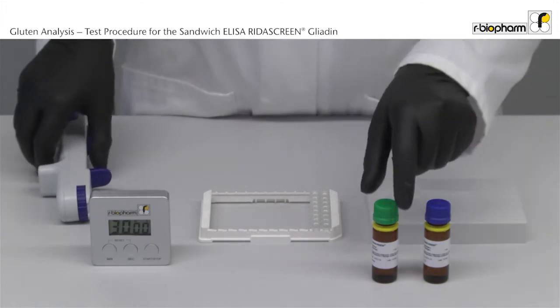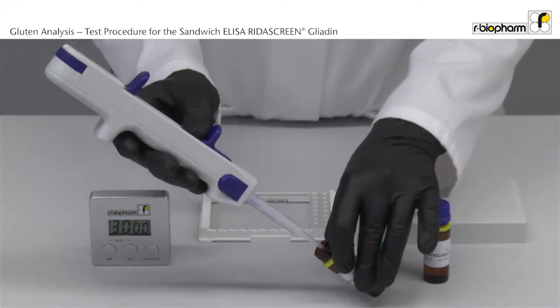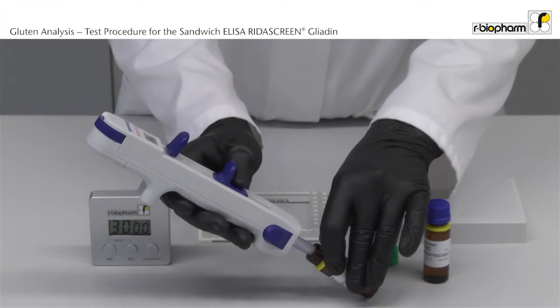After washing, add 50 µl of substrate and 50 µl of chromogen solution to each well with the multi-stepper.